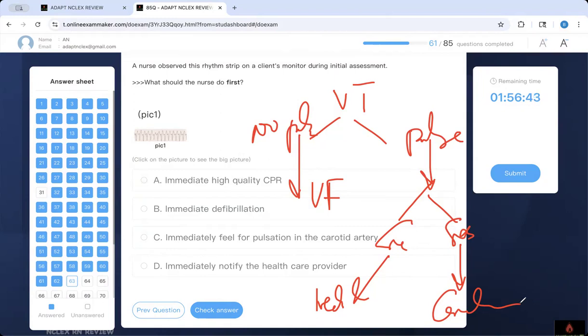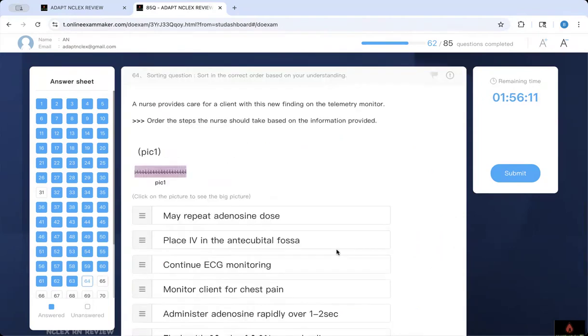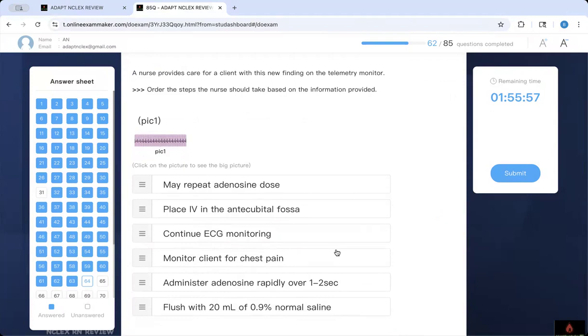I've given you all the information so that when you see the question clinically, this is how you can approach it. Therefore, what do you think we should do? Which answer choice? We need to check a pulse to make sure the patient is doing okay. How are you doing? I know EKG is troublesome. It may be intimidating to you, but you're going through the clinical aspect. You can watch this portion of the video multiple times until you master how to answer EKG questions on the NCLEX. Clinically, you can use this for ATI or other exams. And these are key aspects of the things you should know.